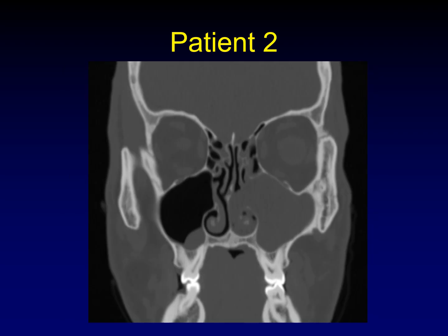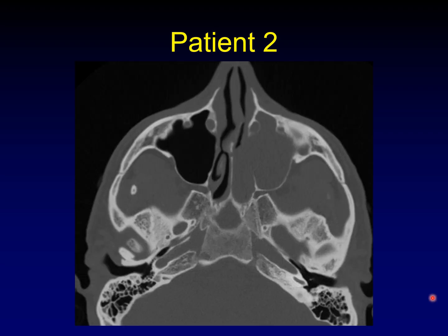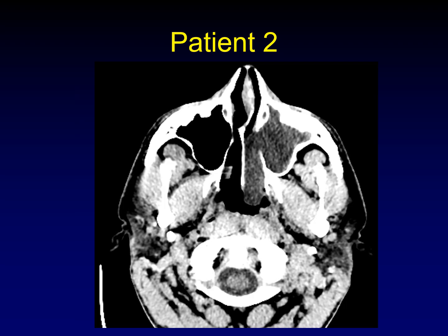Here is patient number two. We have a mass filling the maxillary sinus and finding its way out into the nasal cavity. Here's the axial image on this patient, and you can see the relationship the mass has to the medial wall of the maxillary sinus. In this patient, I don't have an MRI, but I do have a soft tissue window that shows the mass and its extent.